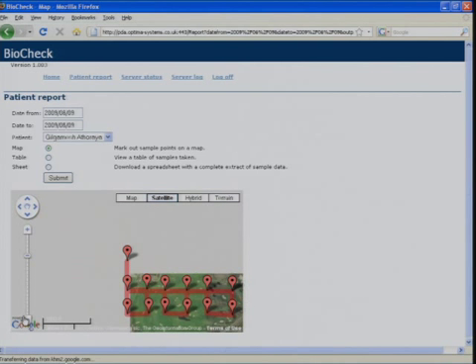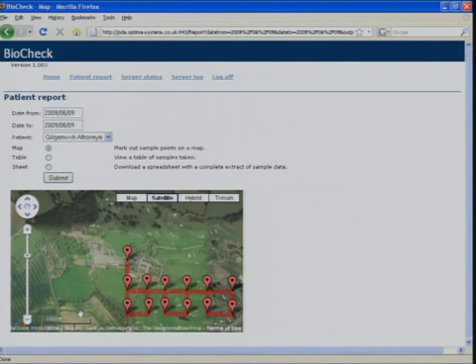It will also show where you've been, so I took a trip that morning. I don't know if you can see that much, or what it spells out. Yes, I've been in the army, very square, running erratically, looking for somewhere to sleep. And again, you can track these to see where you've gone. I haven't played too much with the colouring, but you could put different colour syntax on to show where there's an extremely high heart rate. You could just mark that edge with a different colour.